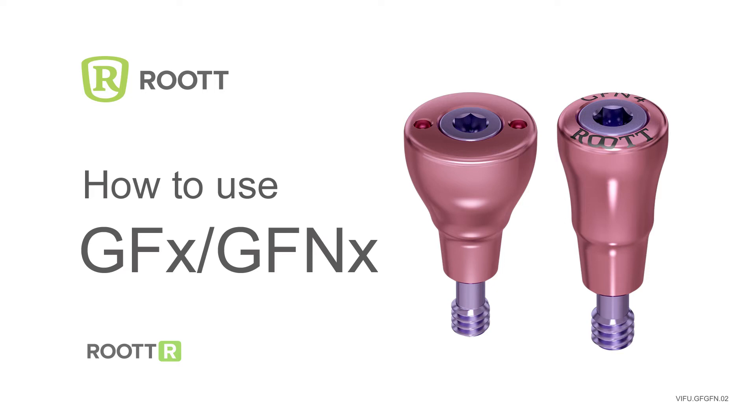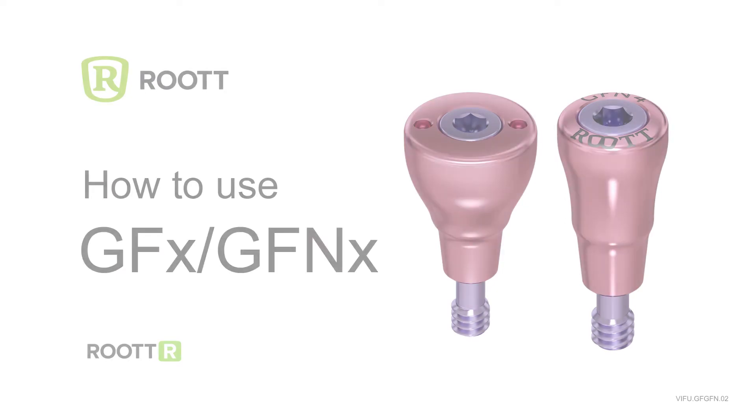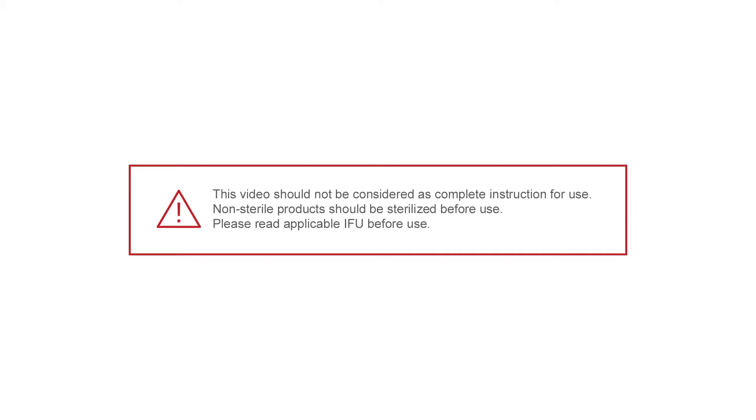How to use healing abutments for Root-R implants. Please read applicable instructions before use.